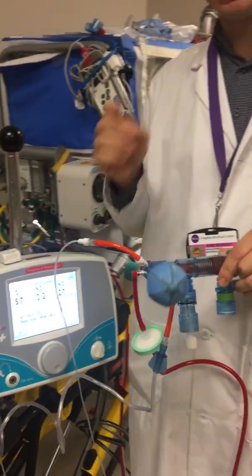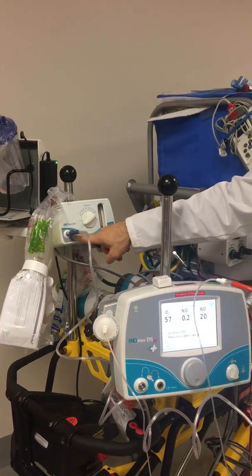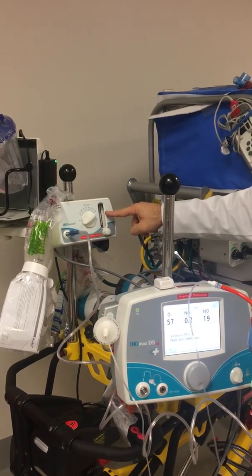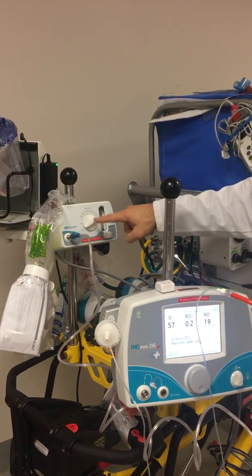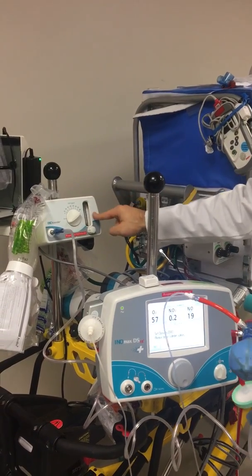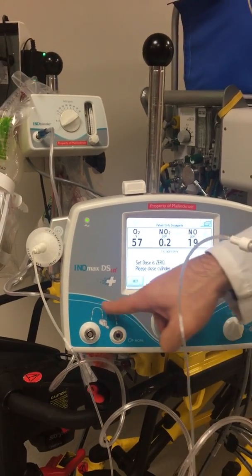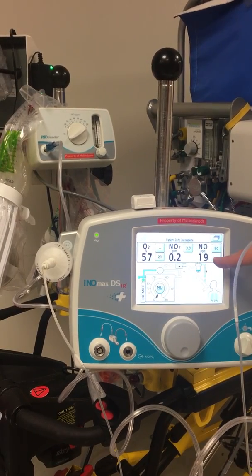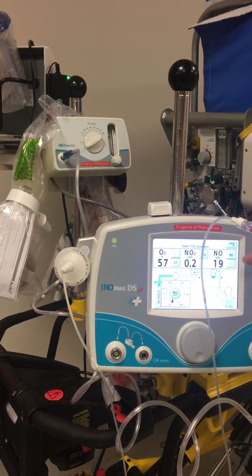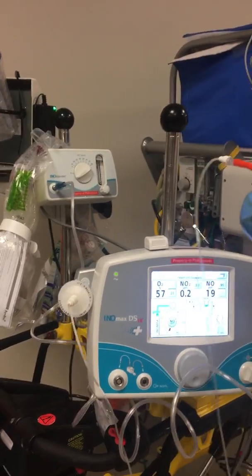When we have to Ambu bag in an emergency, we're going to have to get our Ambu bag, attach it to the inoblender, bring our flow up to 10, and bring our concentration to 20 parts per million — because we're going to Ambu with 10 liters and 20 parts per million. That's a very important thing to keep in mind when Ambu bagging a patient if we're going to take them off the ventilator. The device may display 'set dose is zero, please close cylinder valve' — it doesn't understand because we're not using the injector module, so we just exit that. I can touch up or down on the liter flow to make sure I'm delivering exactly what I want for my nitric. So my FiO2 is being sampled, my nitrogen dioxide is monitored, and my nitric oxide is being delivered and sampled for the patient.